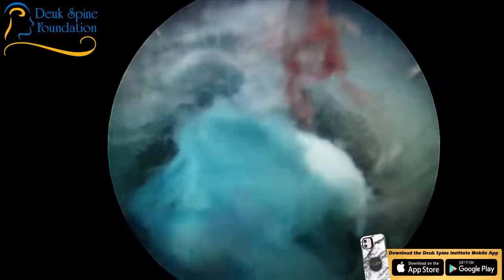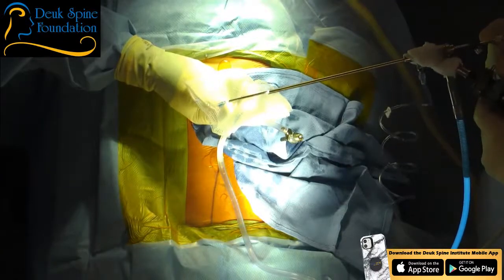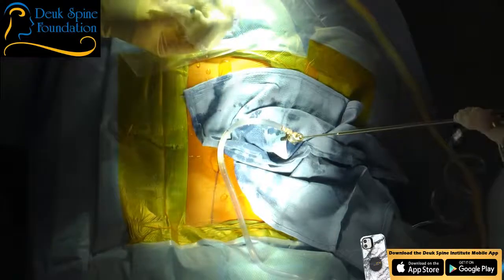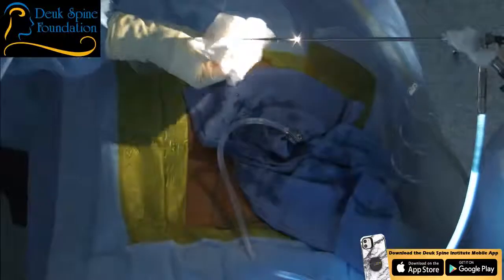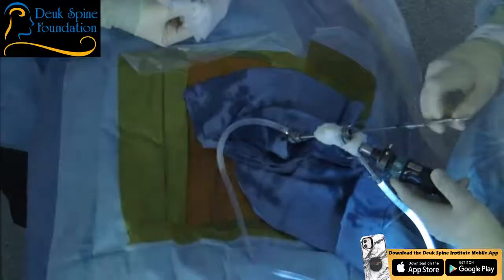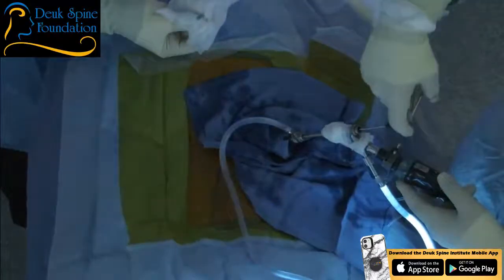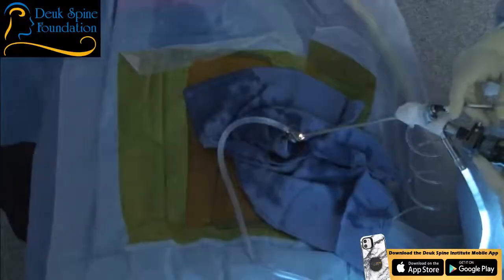We're inside the disc. The blue you see is the nucleus pulposus — that's part of the herniation. Last week we got a really good herniation out — I grabbed it out with an endoscopic grabber designed specifically for this endoscope, out of Germany. The Germans make really high-quality surgical instruments. It's all FDA approved — if you do surgery in the United States with anything that isn't FDA approved, it's basically illegal.